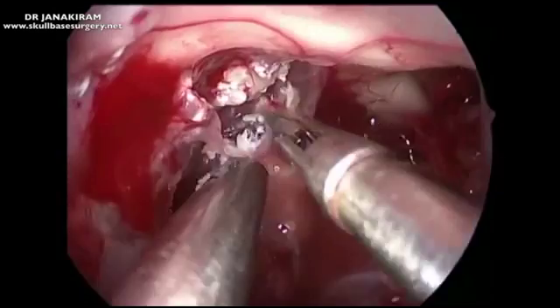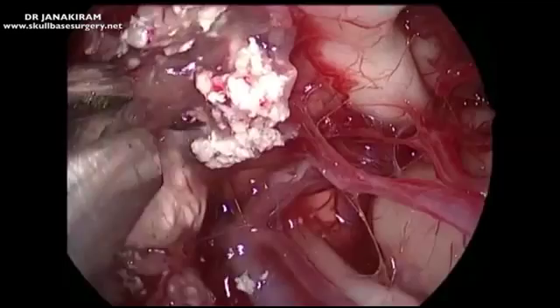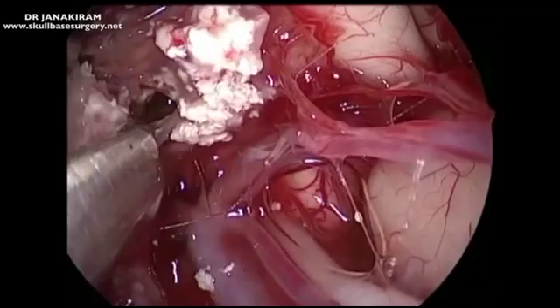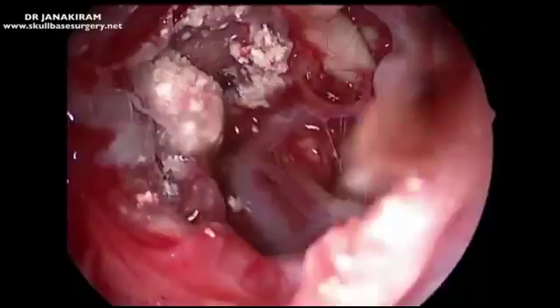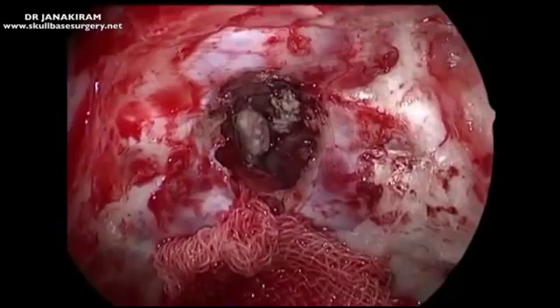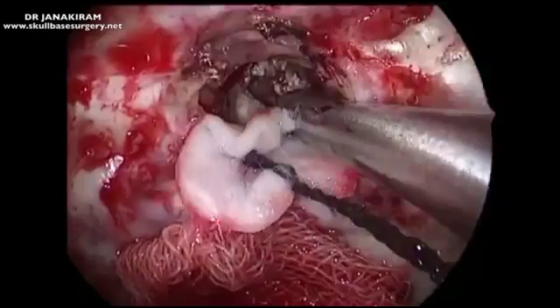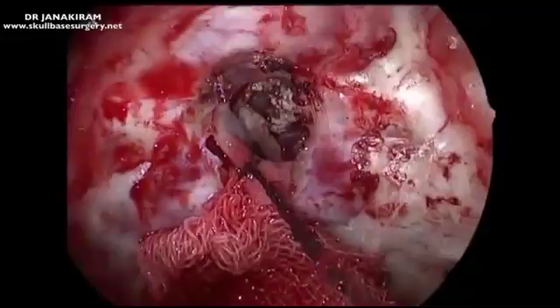That is the portion very firmly adherent to the region of the mammillary bodies and also going towards the thalamus, so we should be very careful there — no traction at all. Now you can see the basilar tip dividing into the P1 segments on both sides. This is a completely unedited video. During the nasal phase we request the anaesthetist for some hypotension, and then once we enter into the dura it becomes normotensive. You can now see that we are placing the lint over the basilar.